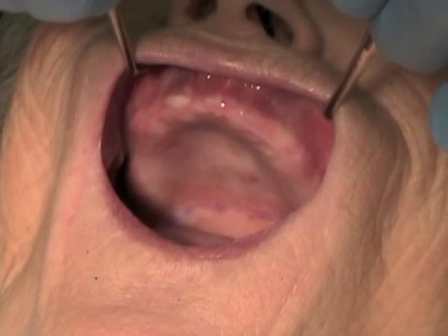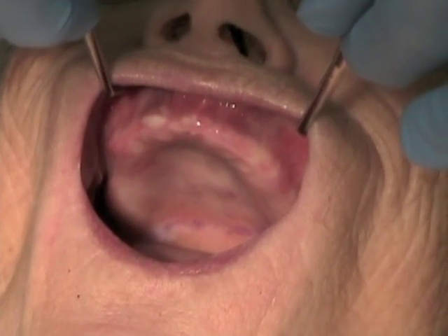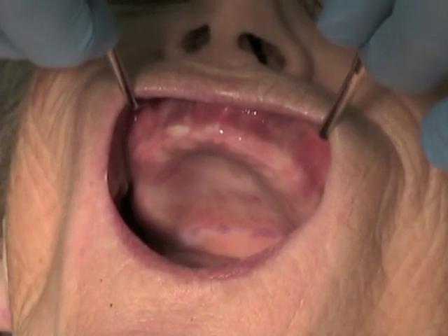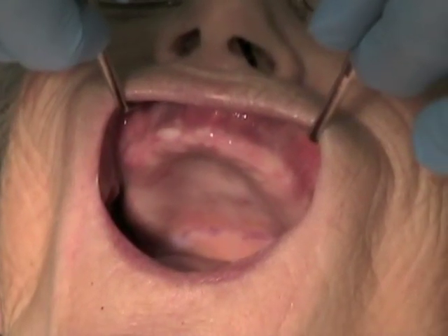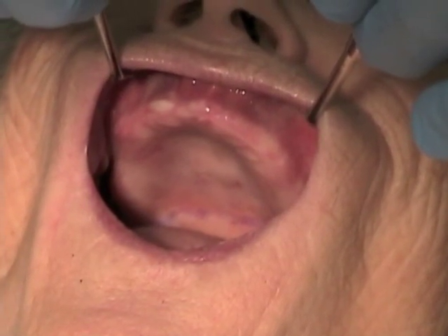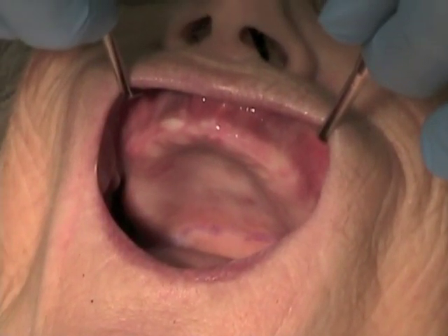The two-mirror impression technique can be used for any impression, but it is particularly helpful when one needs to capture the vestibular role, as for a complete denture or removable partial denture. The goal is to improve visibility. The operator holds one mirror, and the assistant holds the second.